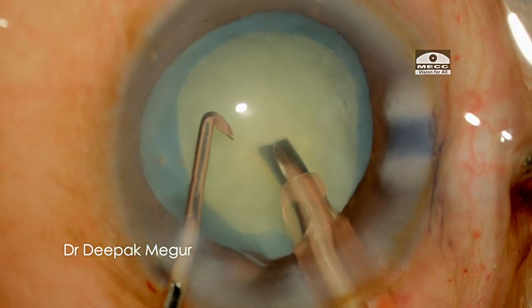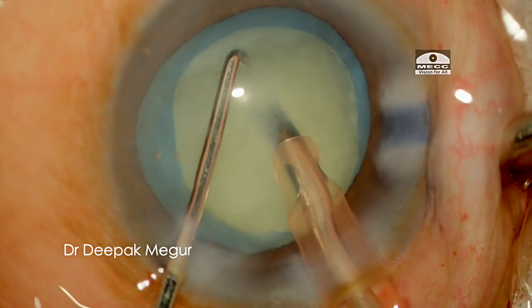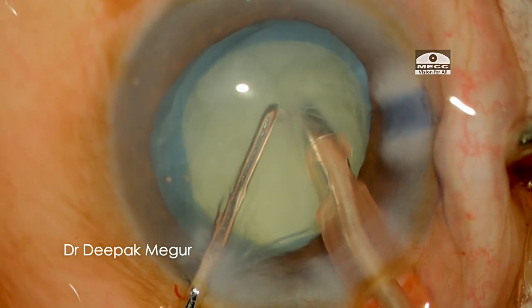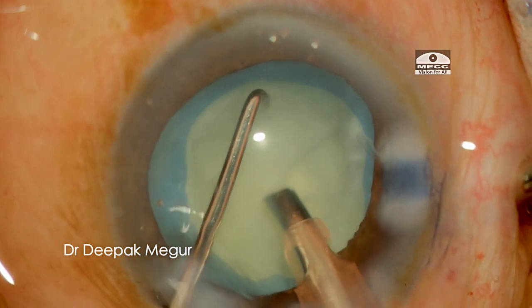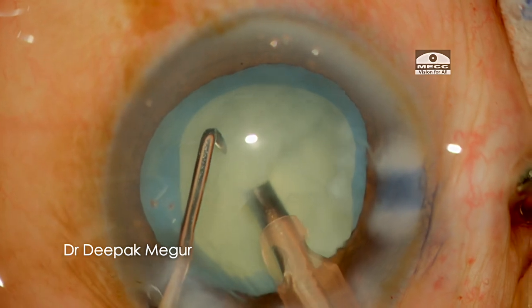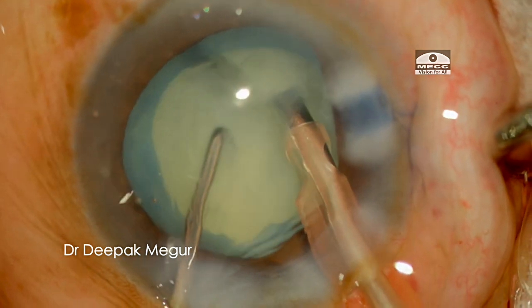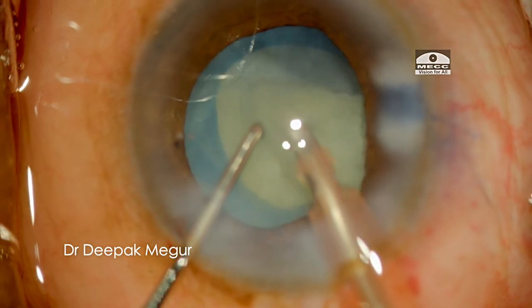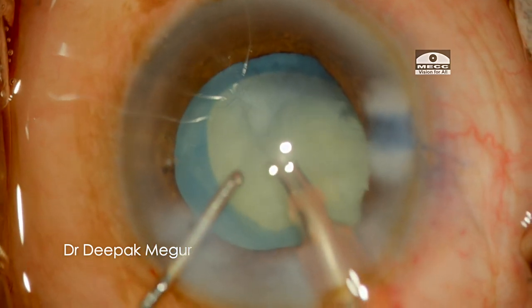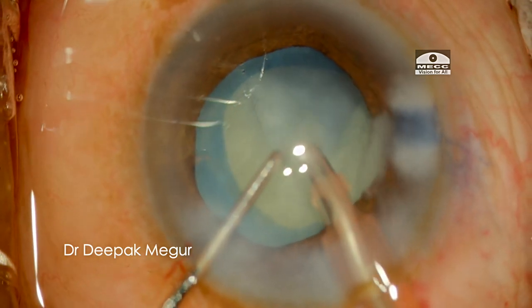I do not perform any hydrodissection and there is no rotation of the nucleus. A direct vertical chop is performed. Care is taken that the lateral separation and rotation maneuvers are very gentle to avoid any stress on the capsular edge and zonules. A tricky aspect of this case is that the torn anterior capsular edge is hidden under the pupil, so I am unable to assess the flap motility sign — a valuable indicator for monitoring posterior extension of the anterior capsular tear if and when it occurs.